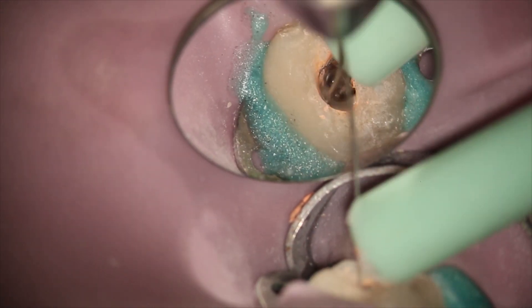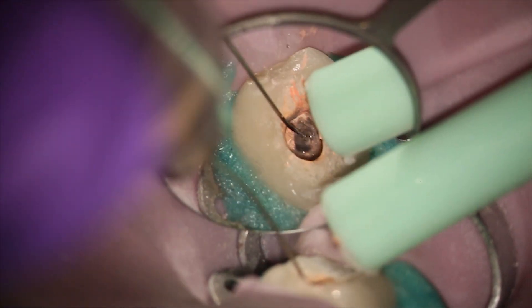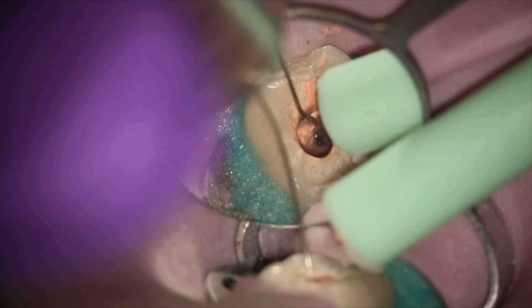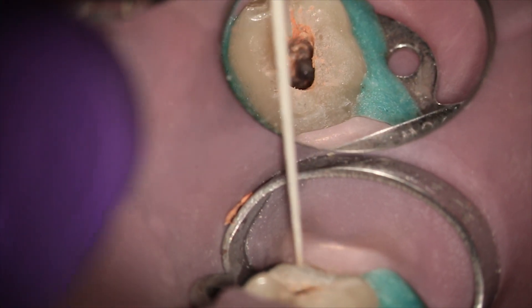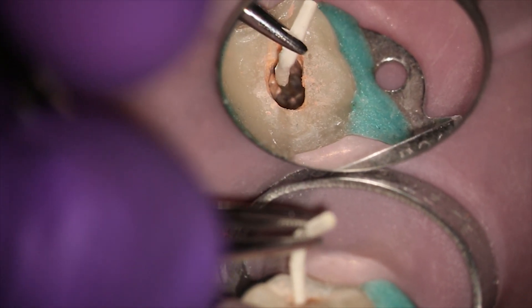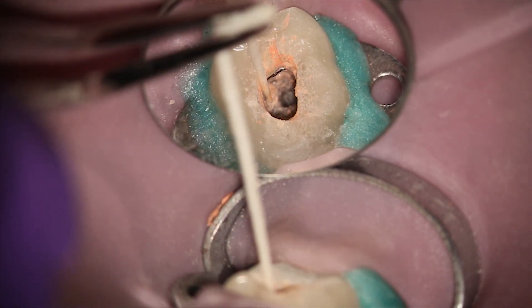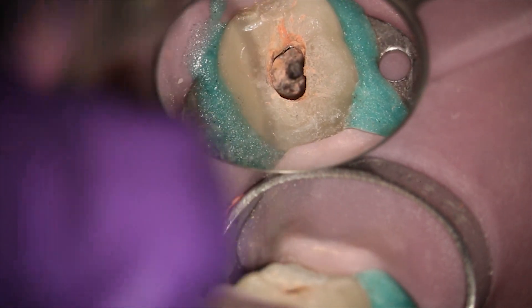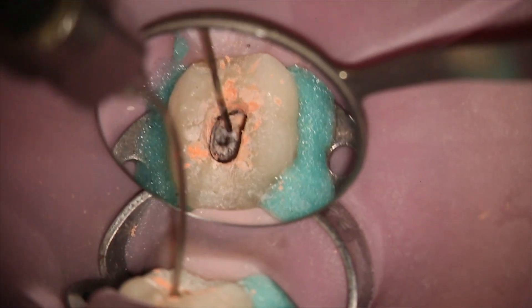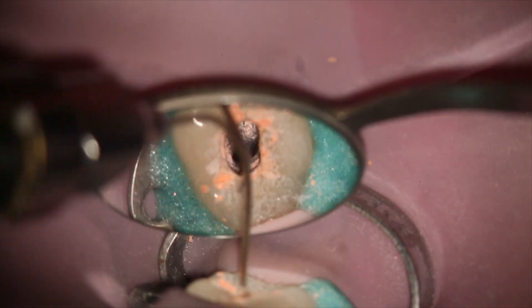You can see she's right on top of the tooth. I did use an M4 here halfway through the procedure, which helped a little with the time factor. Then I go in and do what's called wicking — we wick these canals after irrigation with chloroform, and I'll do this wicking maybe five, six, or seven times until all the gutta percha is out of the canal.